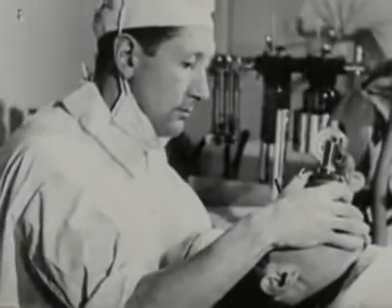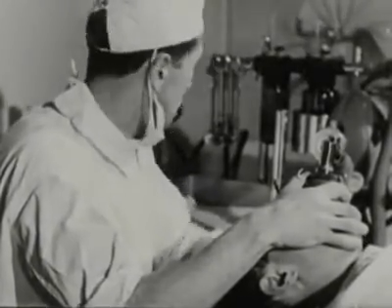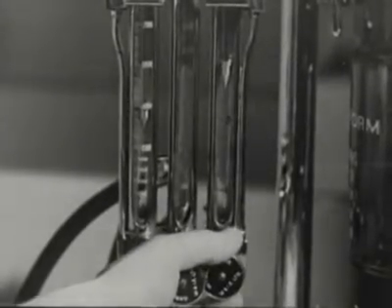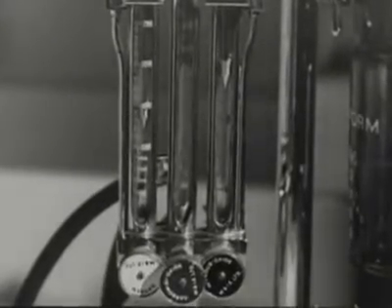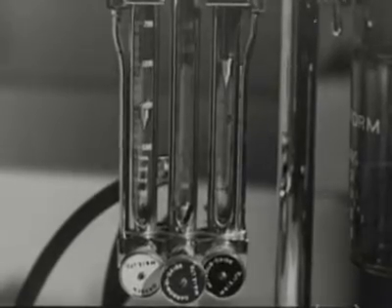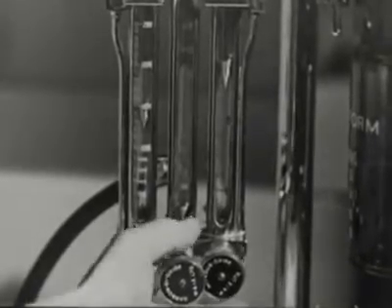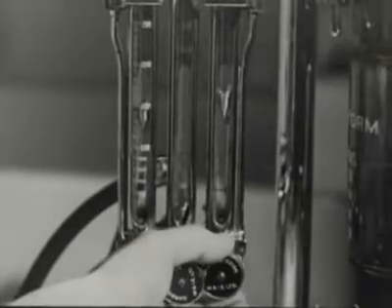When the ether tap is full on, you can lower the flow of nitrous oxide by degrees to 5 liters a minute, without risk of the patient coming up to the second stage. One of the few dangers of nitrous oxide anesthesia is that prolonged oxygen lack may produce permanent cerebral damage.